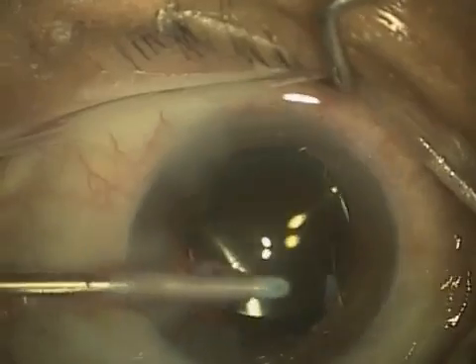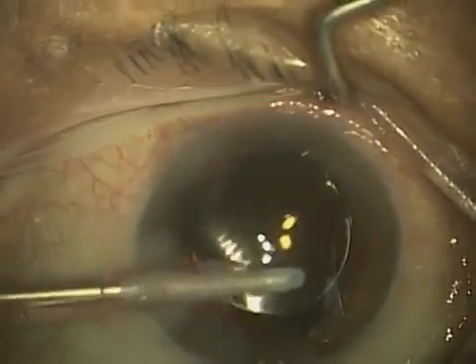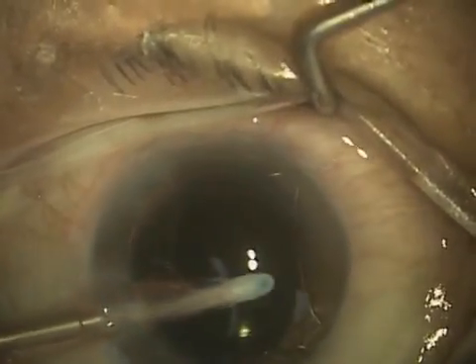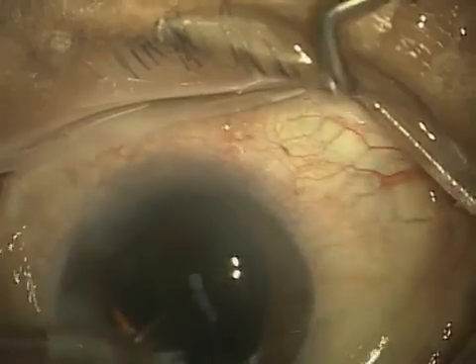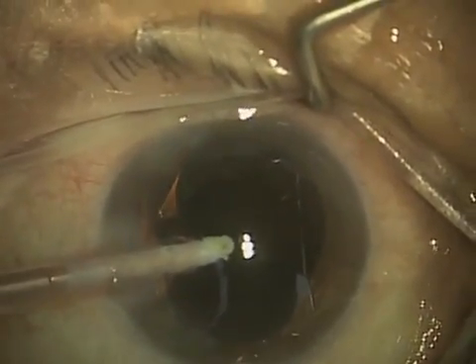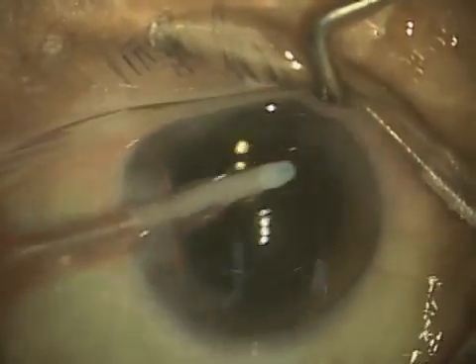You see the patient moved a little bit, and again, that's relatively common when somebody suddenly has clear vision because the lens is now in the eye. They want to look around, so I generally just gently inform them that we're almost done and just need them to keep looking straight ahead for a little bit.